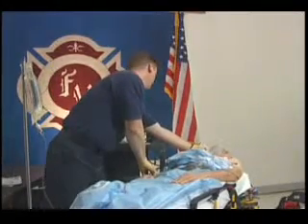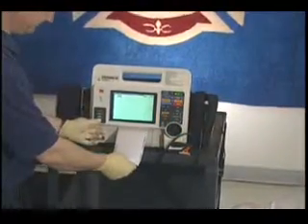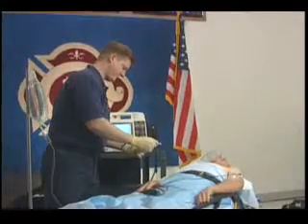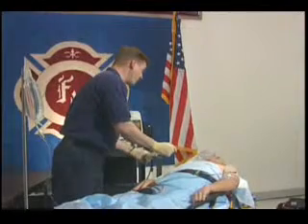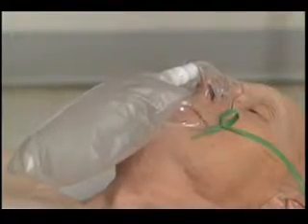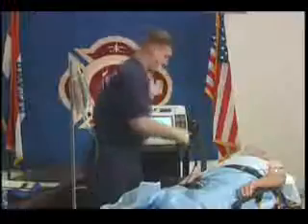All right, sir, how are you feeling now? Sir, it looks like your heart's beating a little slower than we'd like to see. We're going to have to do some interventions to help speed your heart rate up. Okay? It's going to be a little painful, but I'm going to give you some medication that's going to help you not feel as much pain. And are you allergic to any medicine? Sulfur. Sulfur drugs? Yes. Okay.